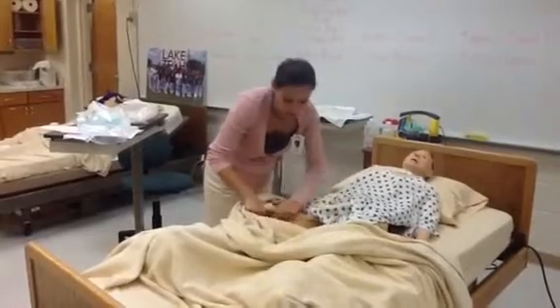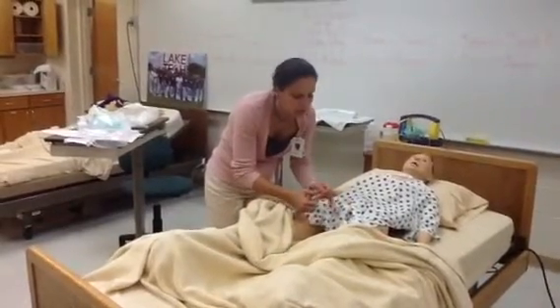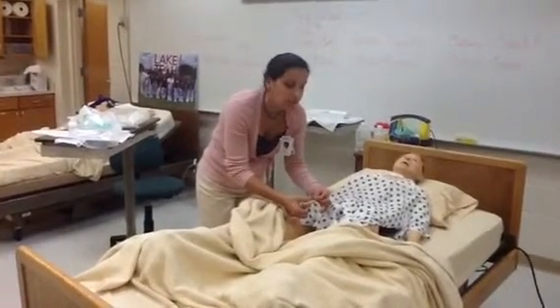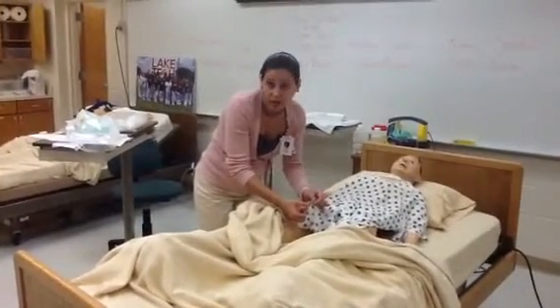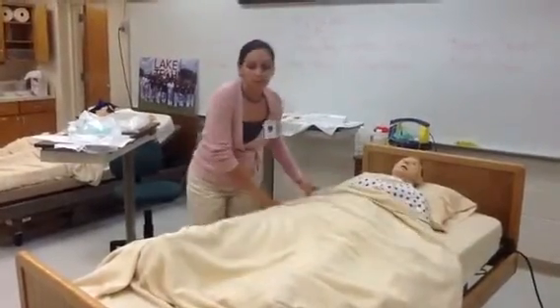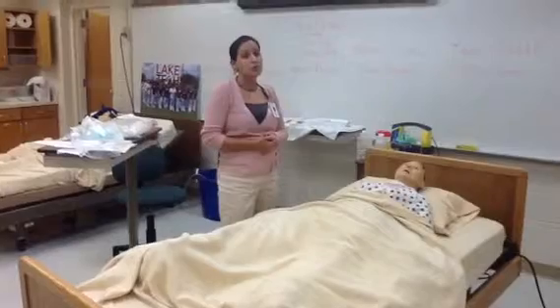If you were not sure about the size that you put in, it is on the catheter itself. So this is a 14 French 5 to 10 ml balloon, and I know I put in 8 mLs, and I would document that. And then I would give my patient some instructions.